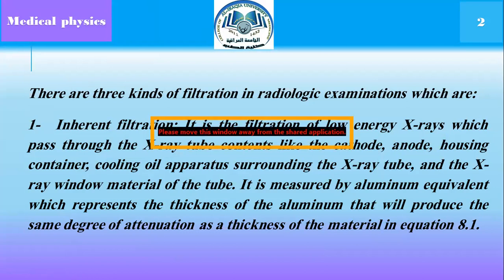It is measured by aluminum equivalent, which represents the thickness of the aluminum that will produce the same degree of attenuation as the thickness of the material.